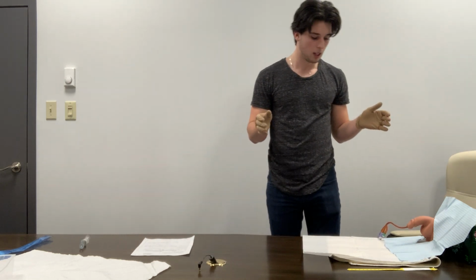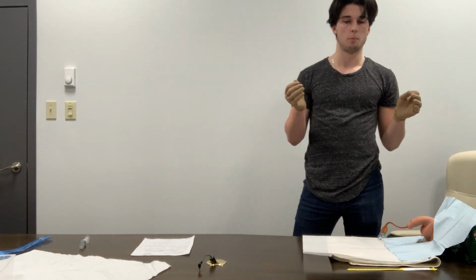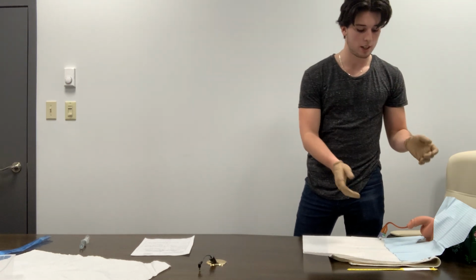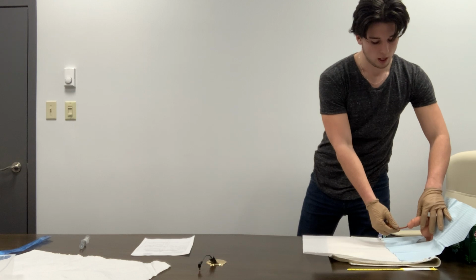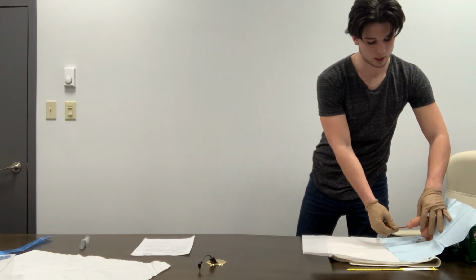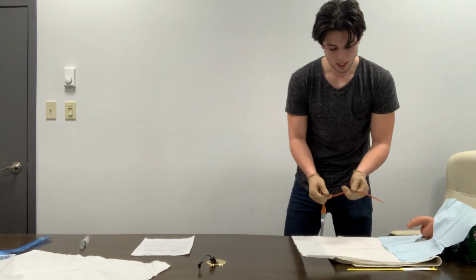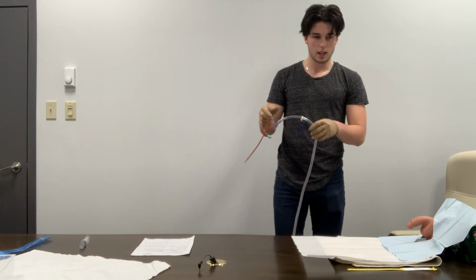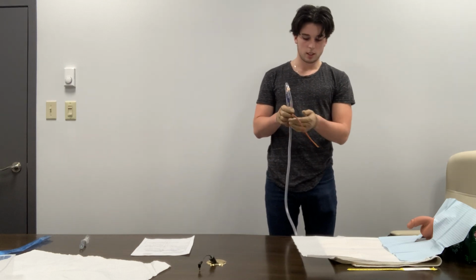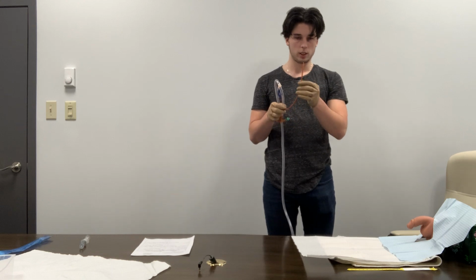Now that that's in the garbage, we can tell the patient to take some deep breaths and bear down as we gently pull out the catheter. So we're going to say, all right, take a couple deep breaths as you bear down as we pull out the catheter. Then the catheter is now out, and we can go ahead and check the tip of it, and we will see that there is no blood and it is fully intact.